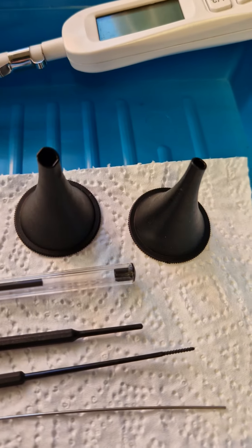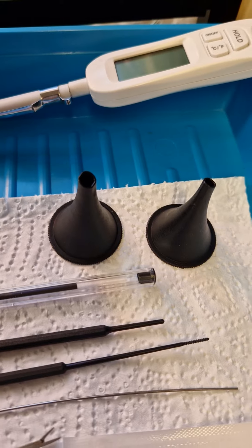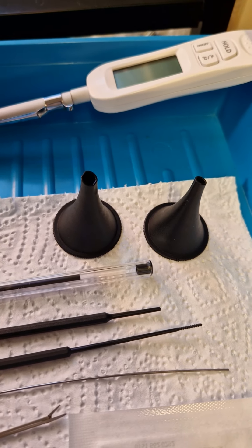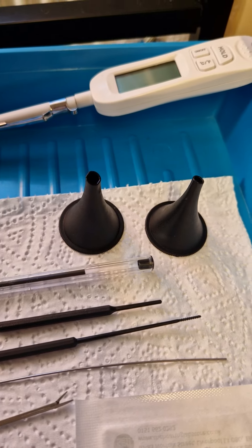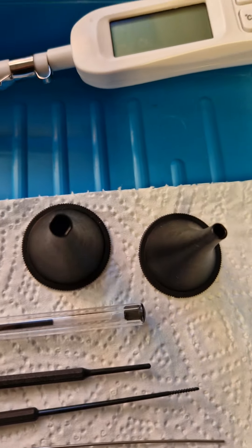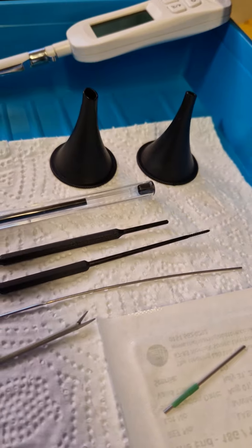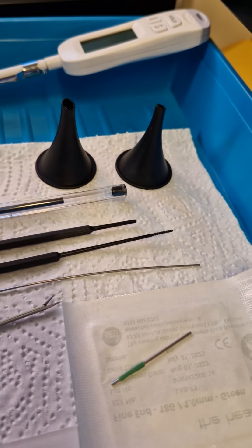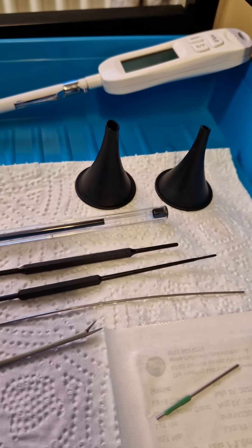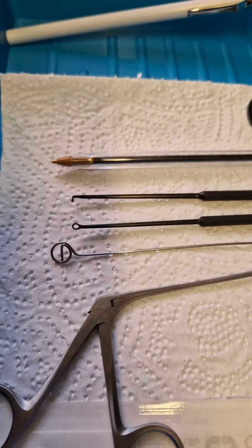These are the specula — we put these into the ear canal and they serve a couple of purposes. They straighten out the bend and make it easier to see inside, and they lightly open up the canal if it's particularly narrow. There are two sizes. They also protect the ear canal wall, which is very sensitive, from the tip of the suction tube, which can be quite sharp — you do not want that touching your ear canal.